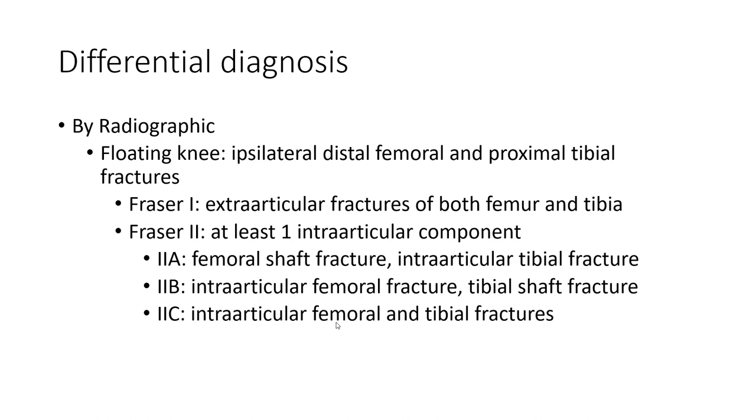Radiography. The differential analysis can be divided into two groups. Group 1: extra-articular fracture of both femur and tibia. Group 2: at least one intra-articular component. 2A: femoral shaft fracture with intra-articular tibial fracture. Group 2B: intra-articular femoral fracture with tibial shaft fracture. Group 2C: intra-articular femoral and tibial fracture.